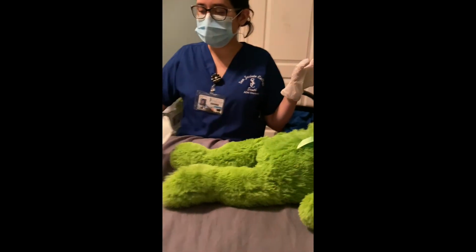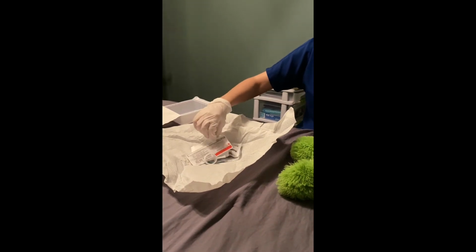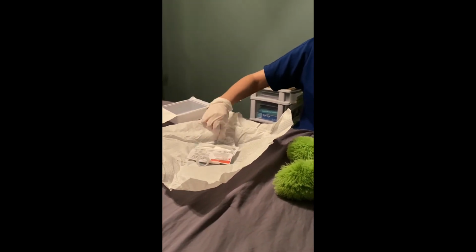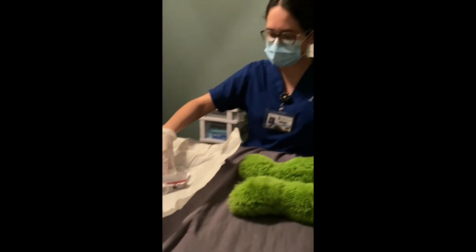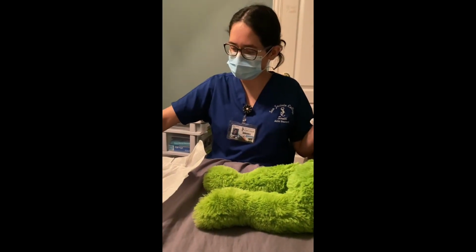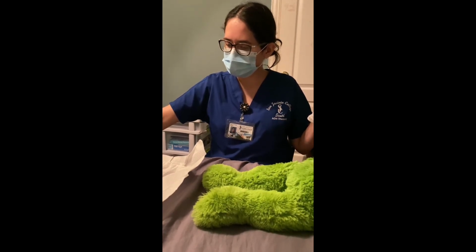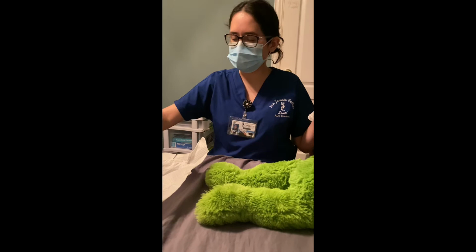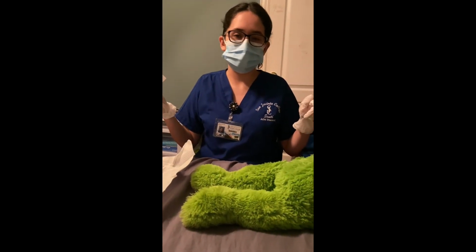So since this area is still sterile, I'm going to grab this, and I'm going to wait for the ChloraPrep to air dry.